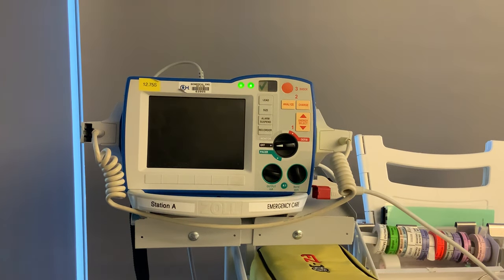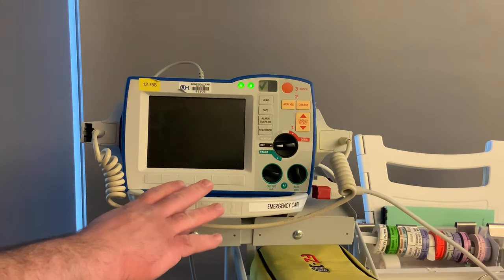Hello everybody, this is Mike and Matt from the Center for Life Support with our review on the Zoll R Series. So we're going to talk about the Zoll R Series.